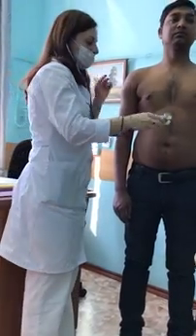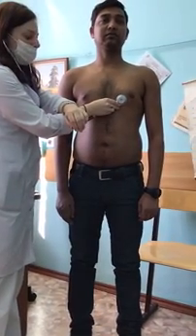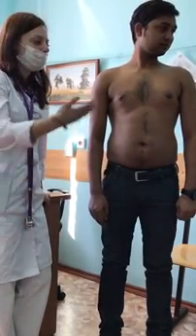We must count the heart rate. If the rate is regular, we may count for 15 seconds and multiply by 4, as with the pulse. If the rate is irregular, we must count for a full minute. The heart rate of this patient is 72 per minute. If it is less than 60, that is bradycardia; more than 90 is tachycardia.